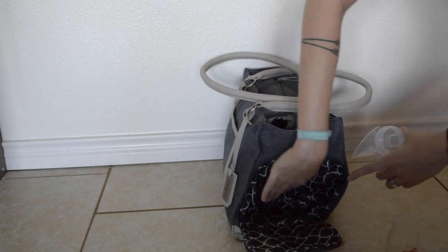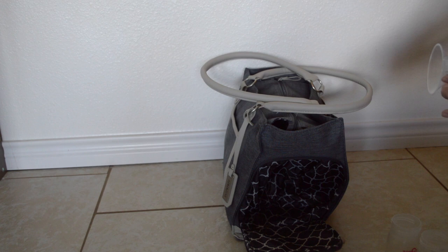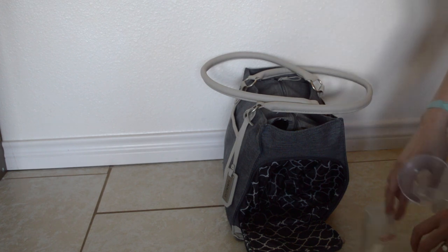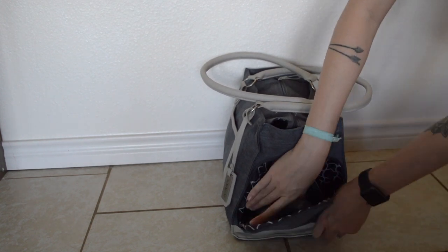I have tried to fit my pump in this side pocket, and if you stretch it you can zip it, but it's kind of complicated. I find it easier to put the pump in the main compartment and keep this pocket for all of my pump parts — I just throw them in there after I dry them.